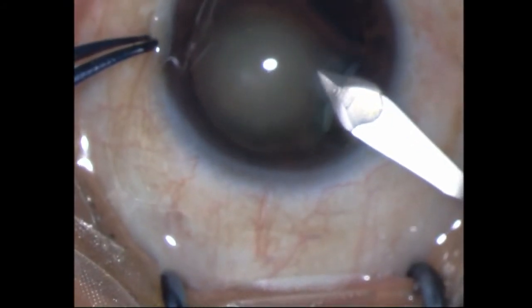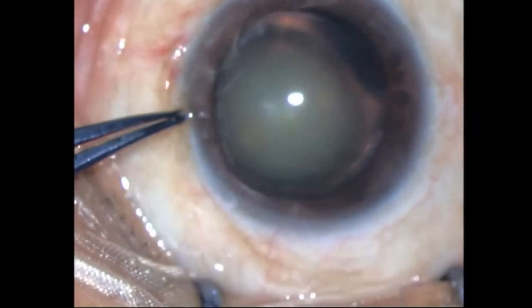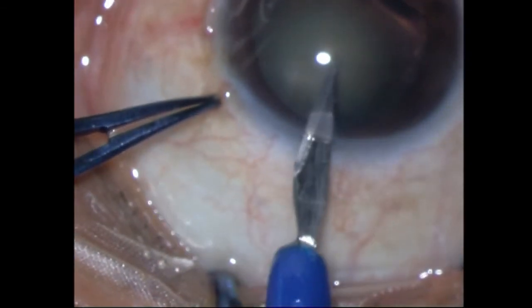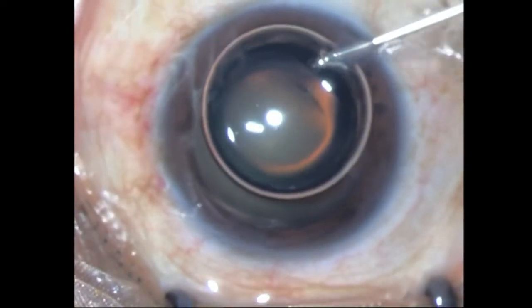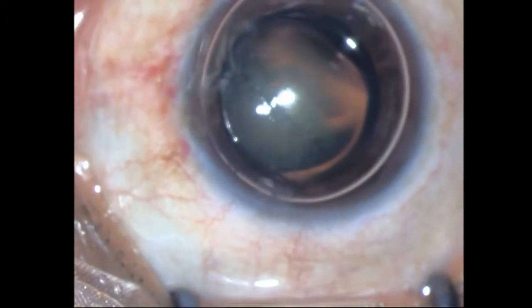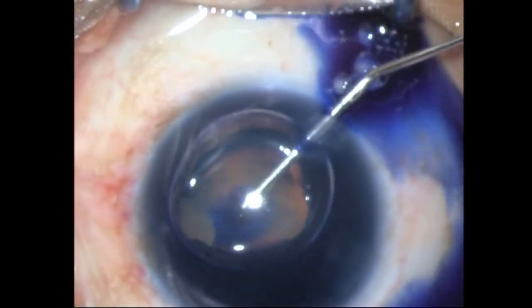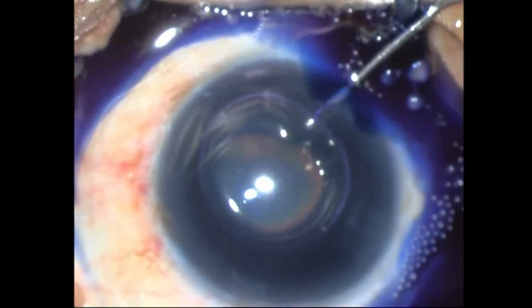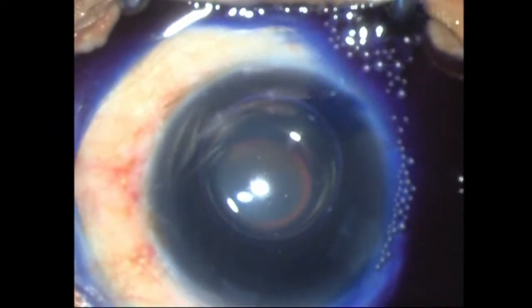I then go ahead and put in some air, filling from the other side as well to get a very good complete air fill, and then stain the anterior capsule with trypan blue. At this stage, looking back, I probably should have blocked that colobomatous area with some hyaluronate — however, it didn't matter in this case.